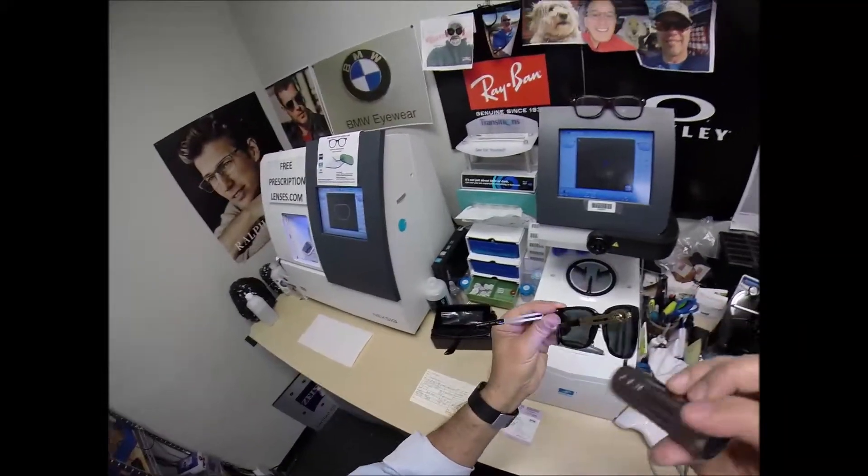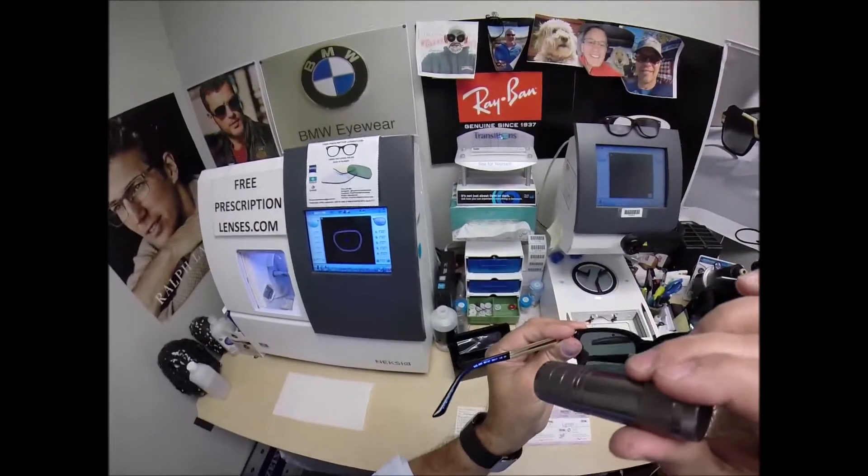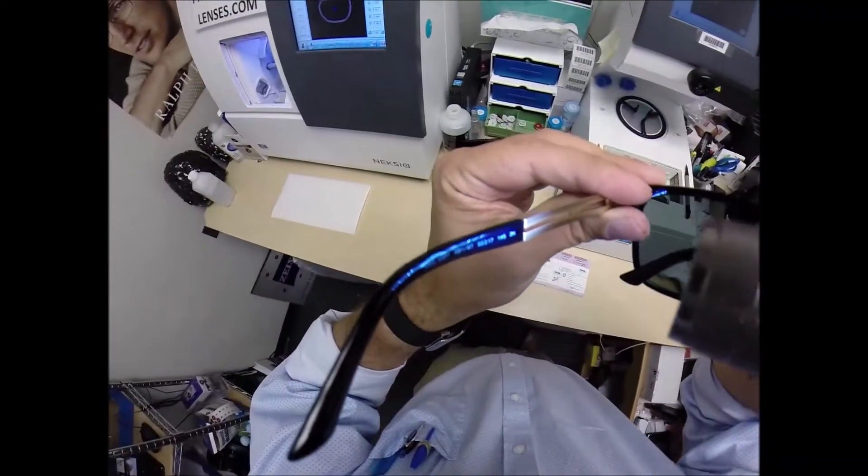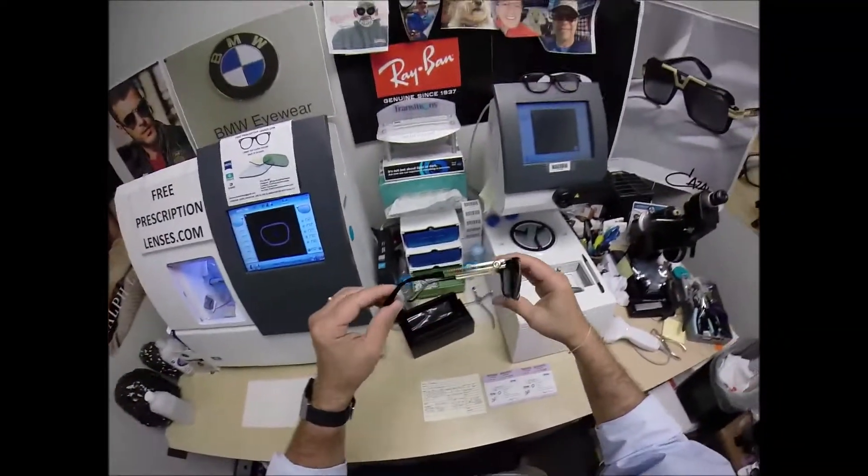This, again, is the model number 4307, color GB1, the classic shiny black, 58 eye size, 17 bridge, and 145 temple length.